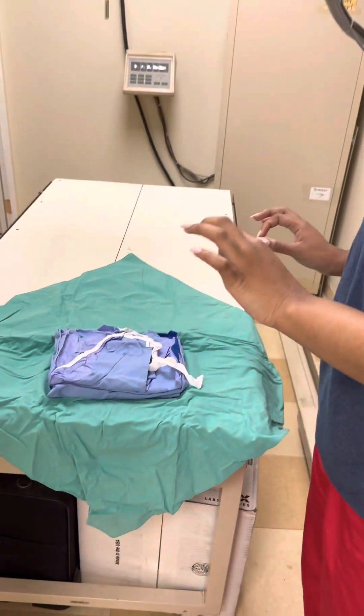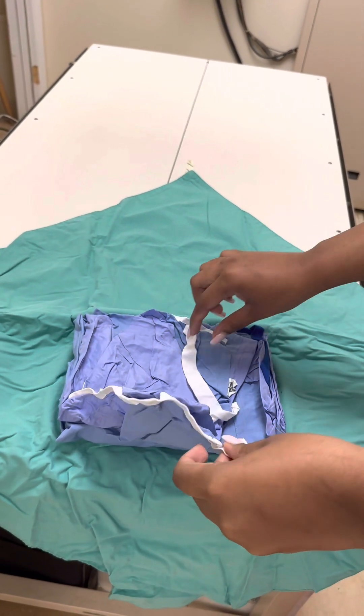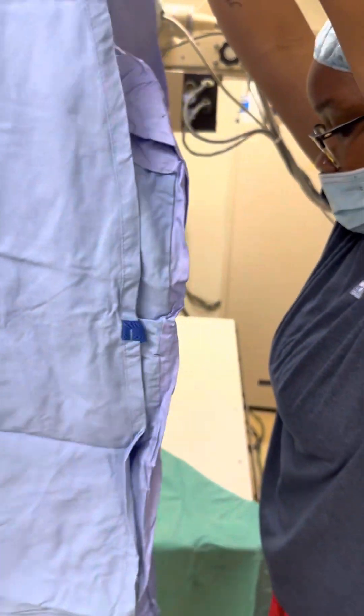So I have my gown and I'm going to pick it up by the neckties with one hand and I'm going to unfold it.